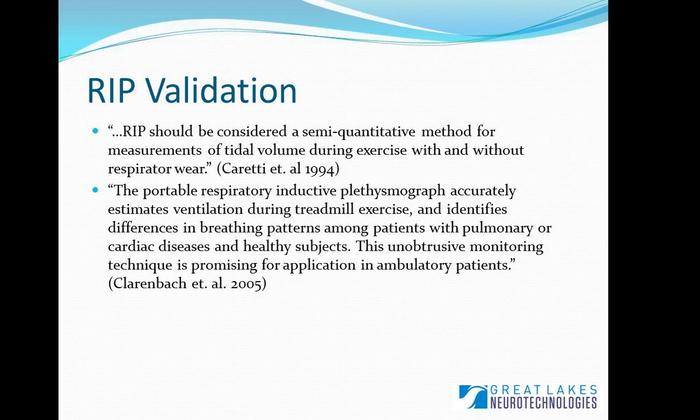Both of these relate to exercise physiology type applications, but there are many publications that have been done, or studies that have been done, really just to validate RIP technology itself, and then also using RIP in specific applications. So it's a very widely used method for collecting data and for respiratory data acquisition.